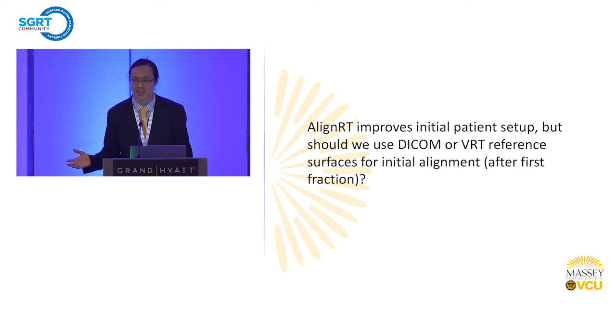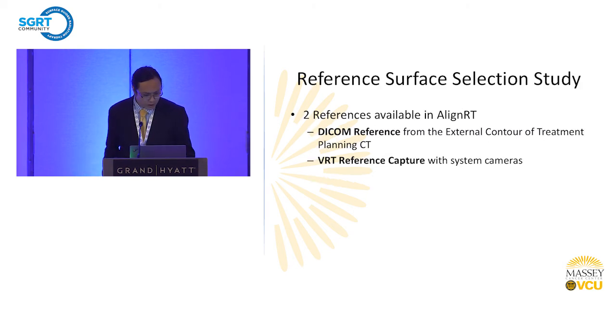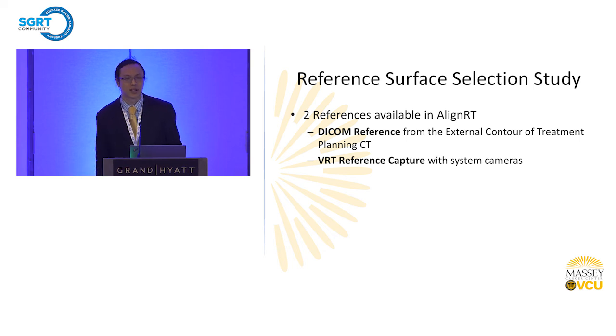Since we're in Atlanta, Georgia here, it's kind of like we have a peach and we have a nectarine. Is there really a difference? So the DICOM reference, that's our external contour. We use that for our first fraction setup.